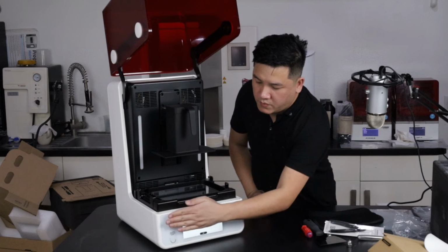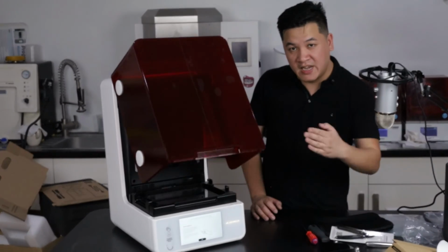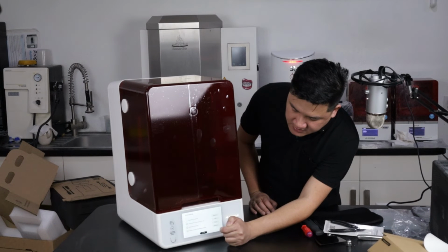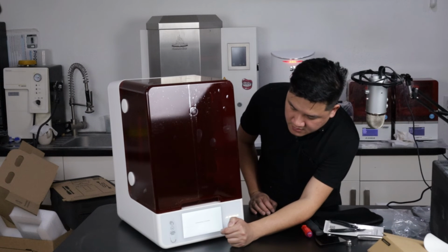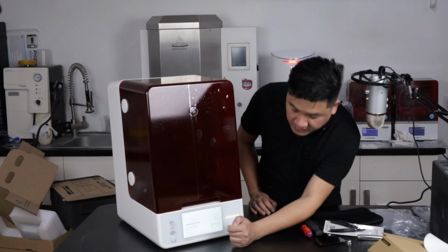So, okay. I thought I was doing like an in and out motion, but I think if you just kind of do like a wave motion back and forth, that seems to work the best. Done. All right. So onboarding complete. Send the build to begin.